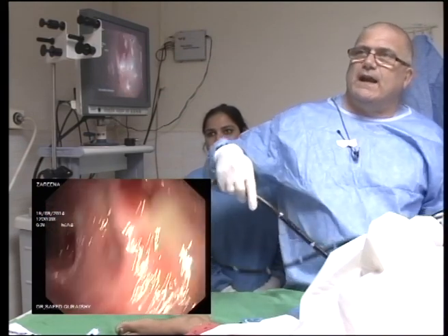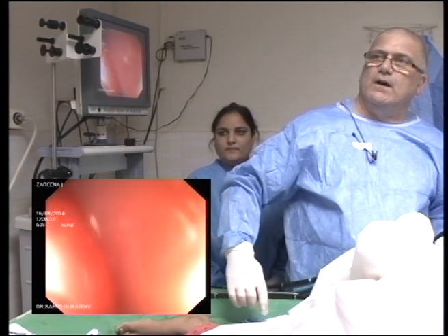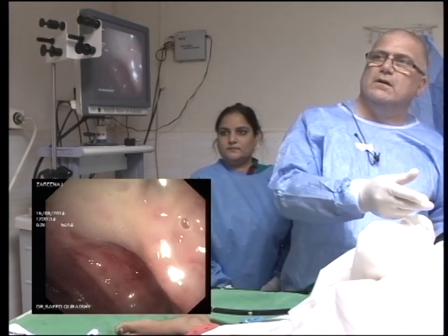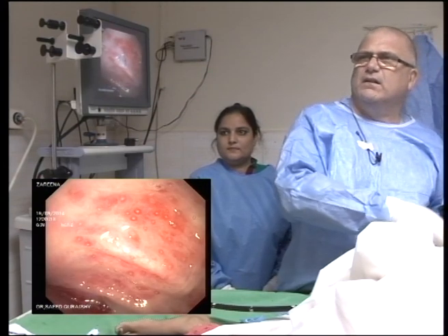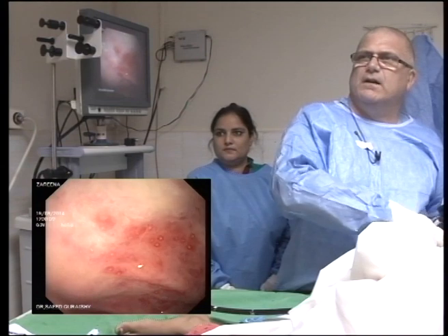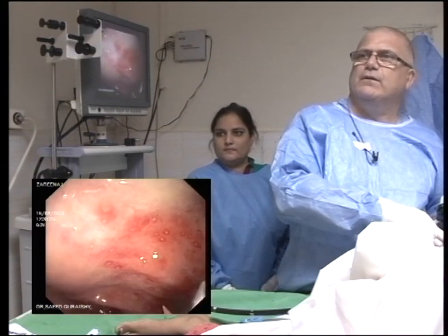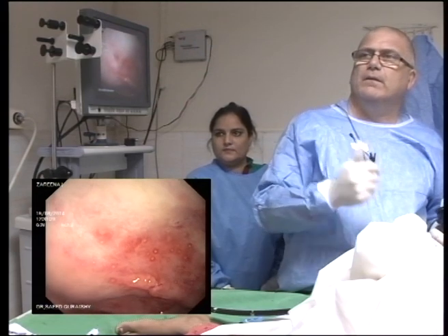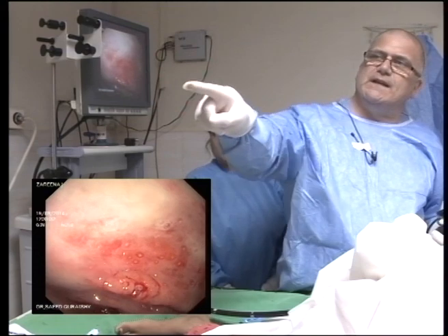So I'll show you that in quick, as in standard, what I would normally do. So you touch, so the forceps will come down, you'll see. I'm not blowing or anything, getting close now. I can feel it rattle, touch, yep, done. And then I pull it, and I see it tent.